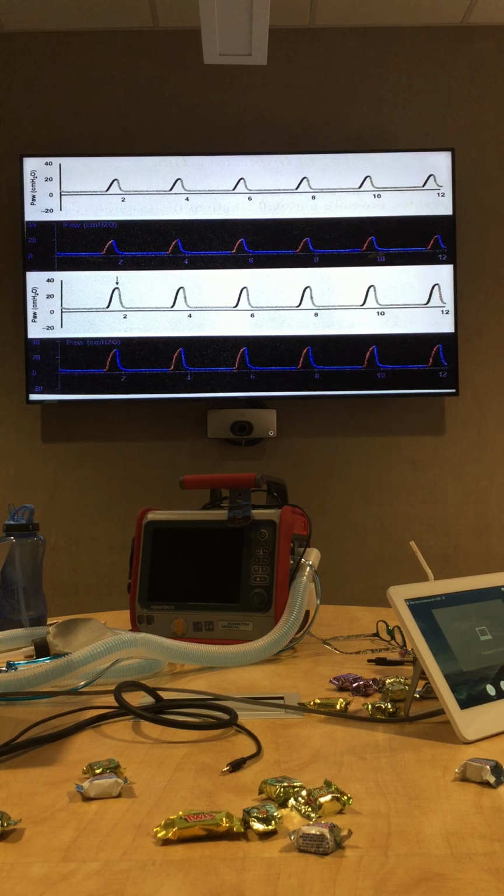What about damage? Because if I give too much pressure, am I going to overshoot the lung by too much pressure and over distend it, its distensibility? Okay, so I'm potentially going to rupture or cause an air leak because I gave them too much pressure. But you could also push out pulmonary edema too, right? You could, exactly. But positive pressure on its own may decrease that.